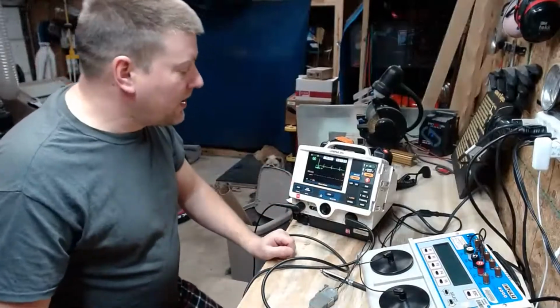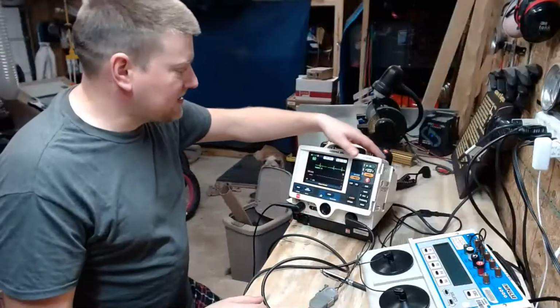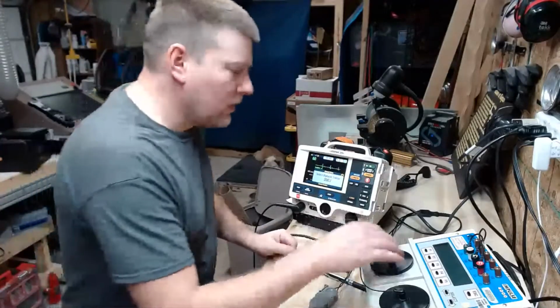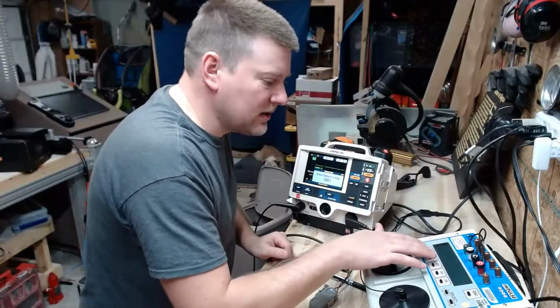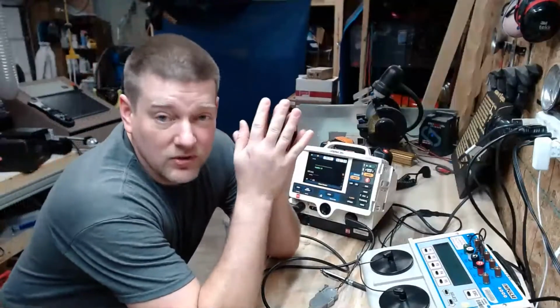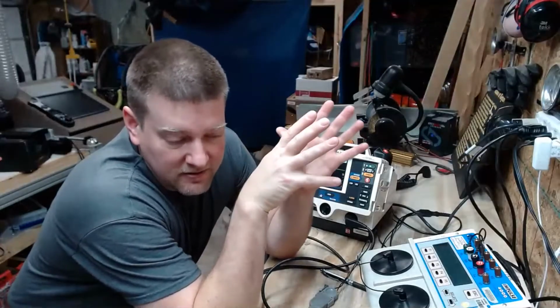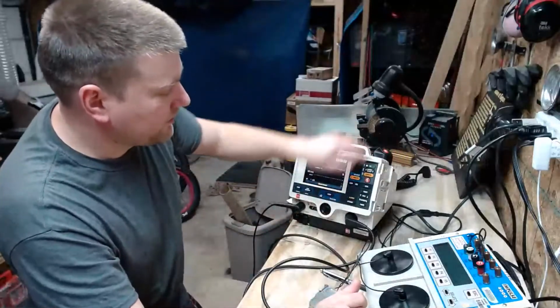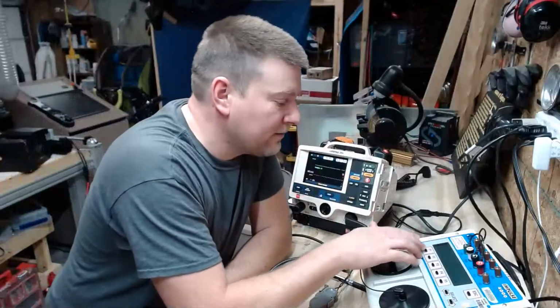All right, here we go. So now that I got the correct polarity, everything's set back up, now I can continue on with some of my other tests. So let's see, I had it at 200. Let's put it back into defib analyzer mode, energy high. Okay, so one of the things that we do have to test on these is whether or not it can detect that it's got a good sinus rhythm, and if it does have a good sinus rhythm, then it should not shock. So that is AED mode. I can do it here, or I can close this fancy little door. So I currently have Defib.